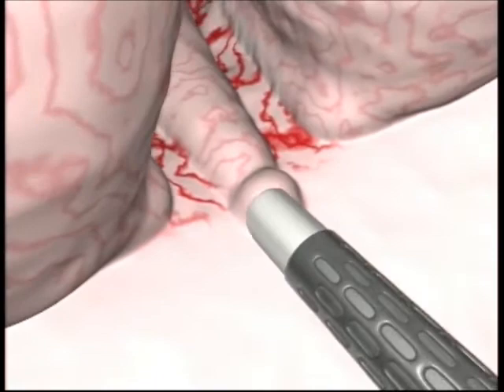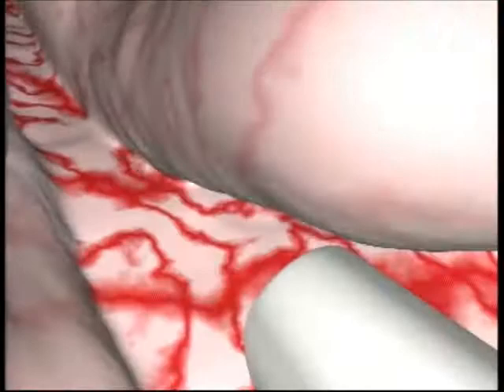Joining the two incisions at the front of the verumontanum, the resector is used as a lever in order to visualise the cleavage area better and divide the circular neck fibres.